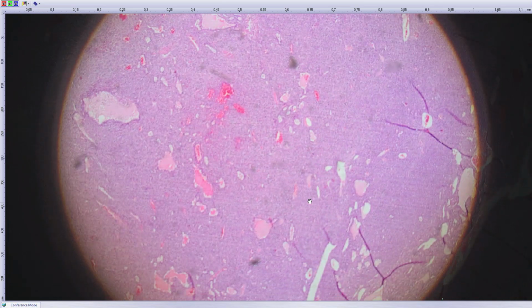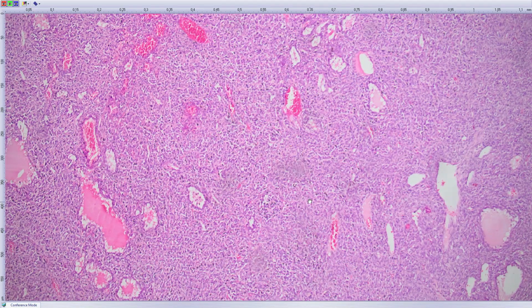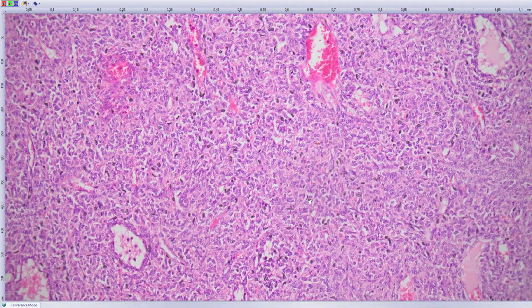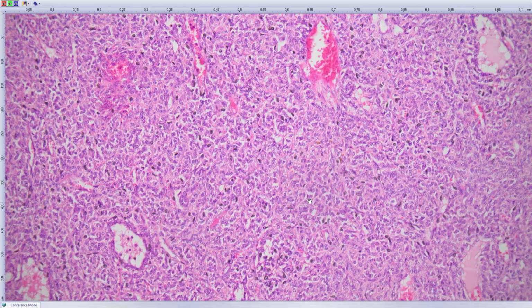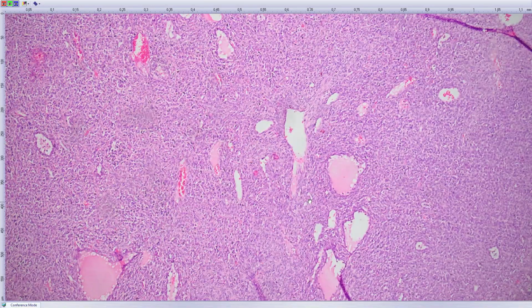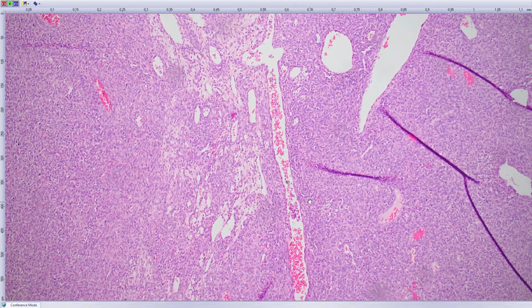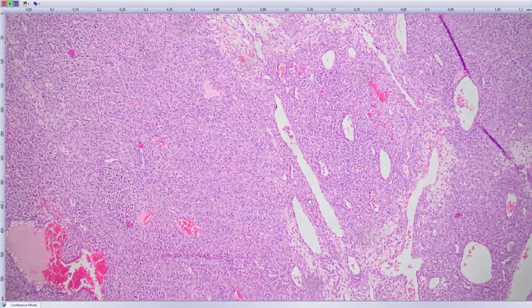And if I go to this very low magnification, you almost immediately have your most important differential diagnosis. So the tumor is composed of this very monotonous proliferation of these ovoid cells, and what is very typical characteristic are these weirdly shaped, sometimes staghorn shaped, vessels, and the tumor will be positive for CD34 and also will be positive for STAT6. And you don't need any other staining because it's solitary fibrous tumor, or previously called hemangiopericytoma in the CNS.